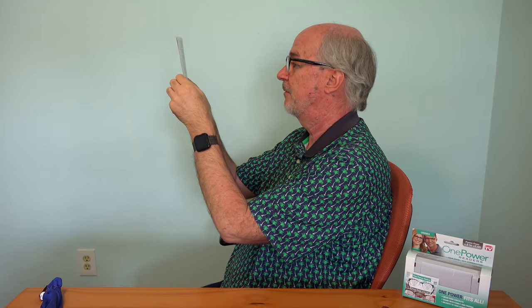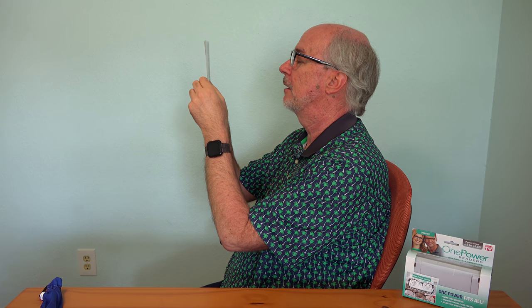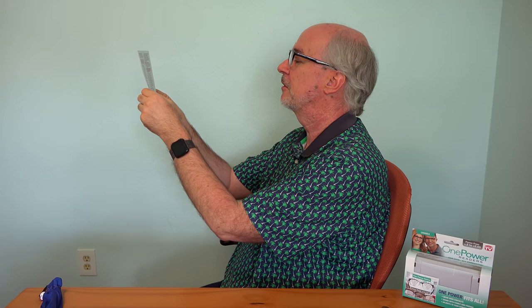Now I'm going to look through the bottom of the lenses. Right about there, gets blurry — so about six inches. Perfect focus, good. Then back to being blurry at that distance.